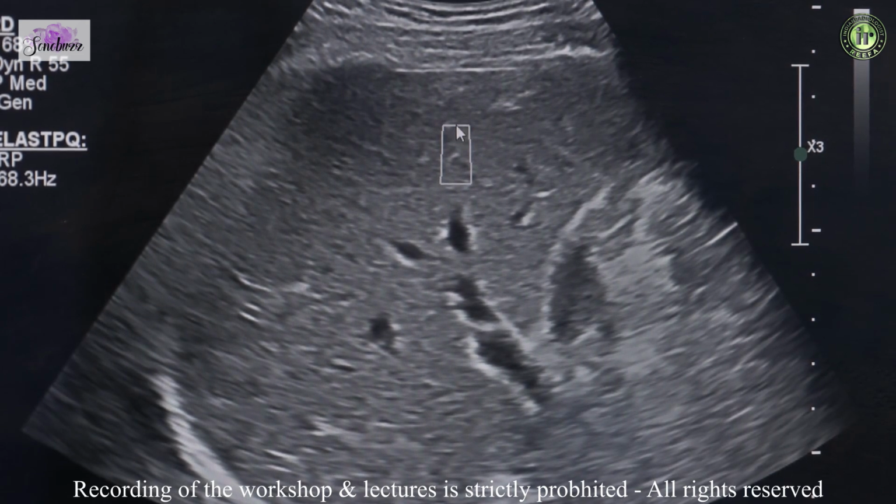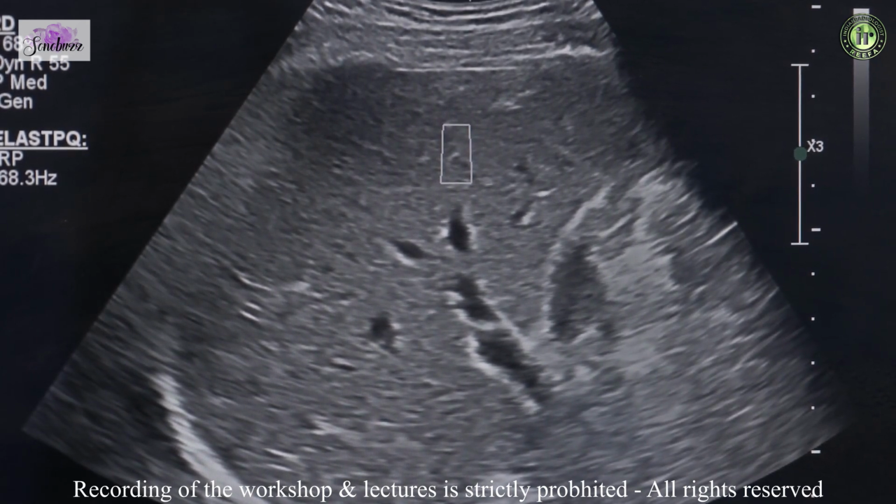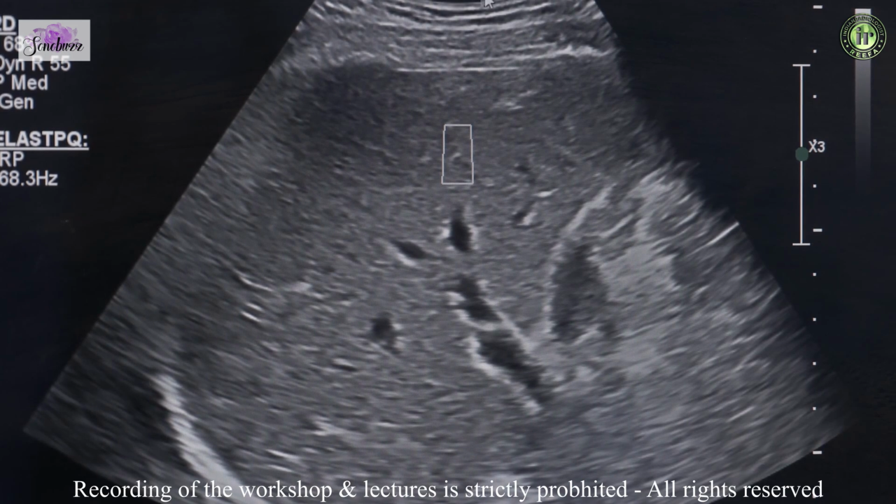Number one, I want the box to be absolutely perpendicular to my ultrasound waves. A very good way of looking at this is to look at these three lines. The first line is the skin surface, where the ultrasound waves are starting. The second is the liver capsule, and the third line that we look at is the top of the box. We have to ensure that all these three lines are absolutely parallel to each other. Once we make sure that this is in place, we are quite sure that the box is absolutely perpendicular, and we can go ahead with our reading.